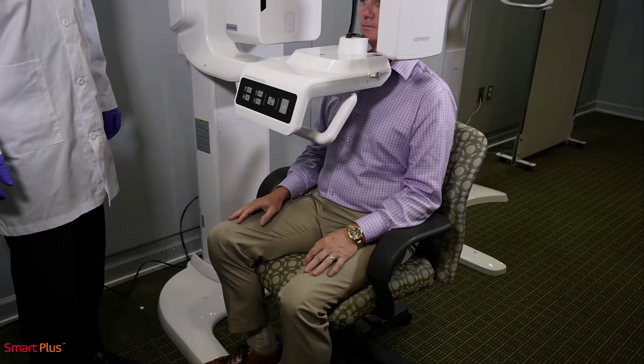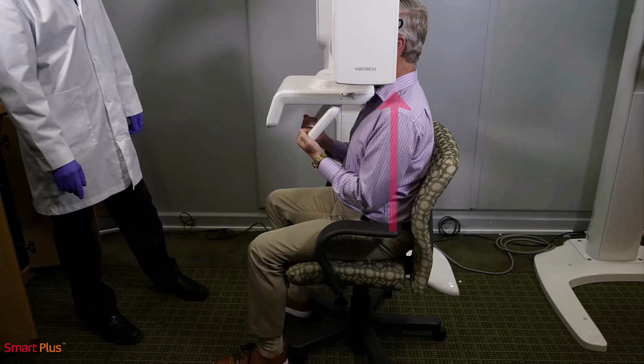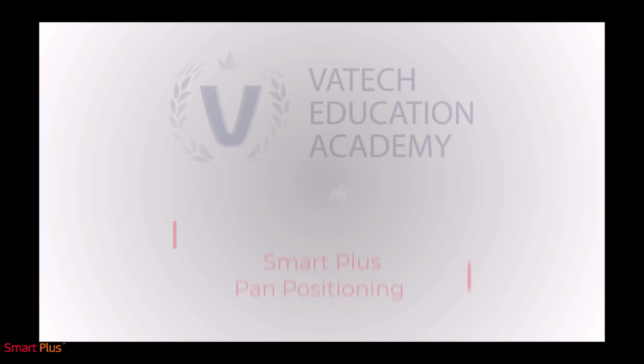You may also have the patient seated if they have trouble standing. Ideally, it is a good idea to use a chair with rolling feet and have the patient slide toward the device. The same protocol applies when the patient is seated. Have the patient hold in the underhand position on the handrails. Have the spine straight up and chest close to the device, and have the patient bite on the bite stick and continue standard protocol.